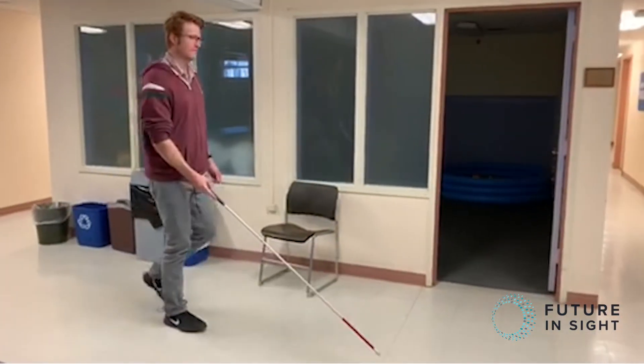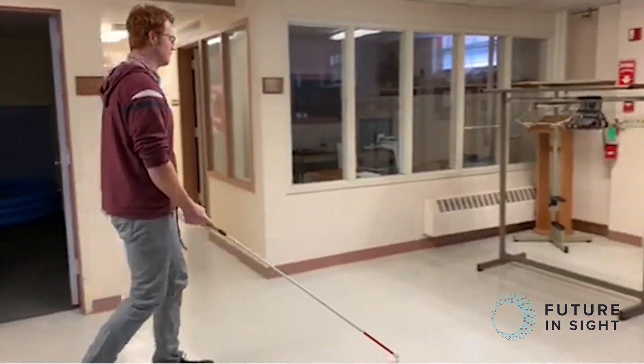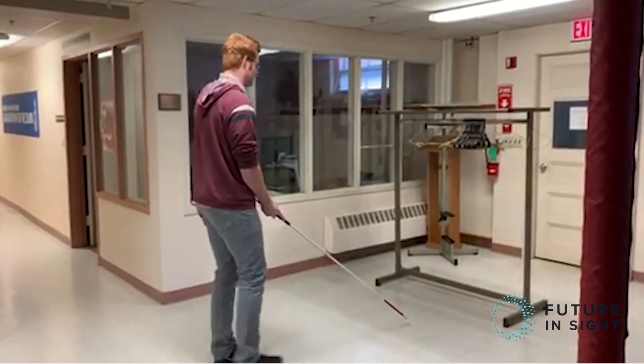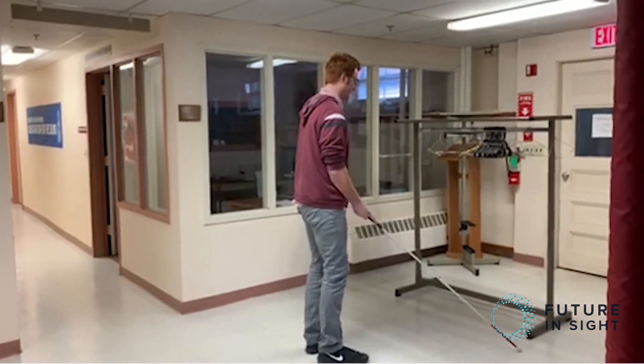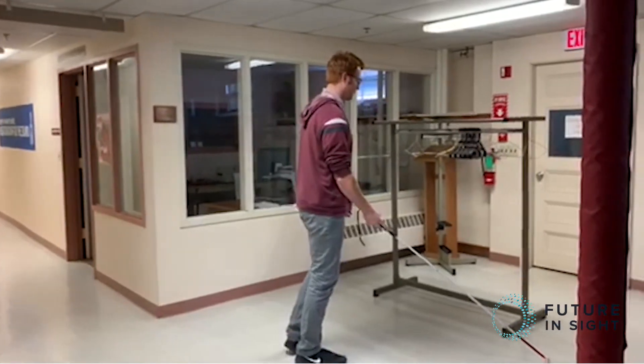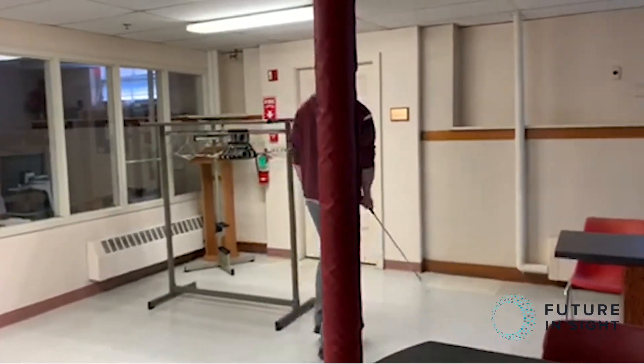I have the Sunuband on. Right now it's doing a light pulsing, starting to feel more rapid pulsing. Now it's a solid pulsing, so I'm going to examine and find out what object is in front of me. Once I discover the object, I can go around it. So as an instructor, you may be wondering how am I going to teach this to my client when I can't feel the vibrations that they are feeling.